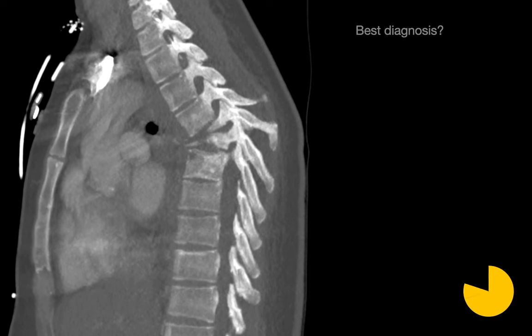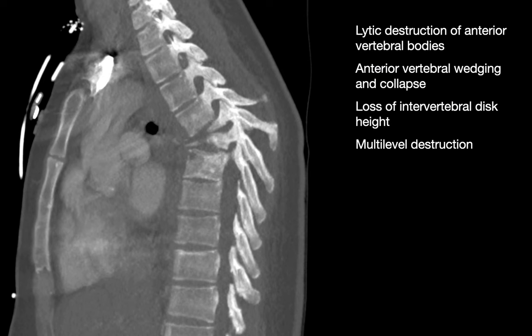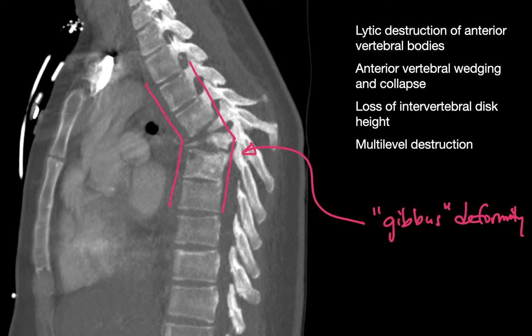What's your best diagnosis? This is a good example of Pott's disease. Characteristics of Pott's disease include spread of infection most pronounced beneath the anterior longitudinal ligament, usually sparing the posterior elements, loss of intervertebral disc spaces, and involvement of multiple contiguous vertebral bodies, resulting in a gibbous deformity of the thoracic spine.